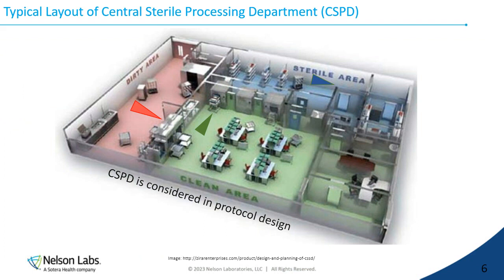One thing I like to talk about is we always make sure that when we're writing protocols or designing cleaning validations, we keep in mind the central sterile processing departments, or sterile processing departments, in hospitals.